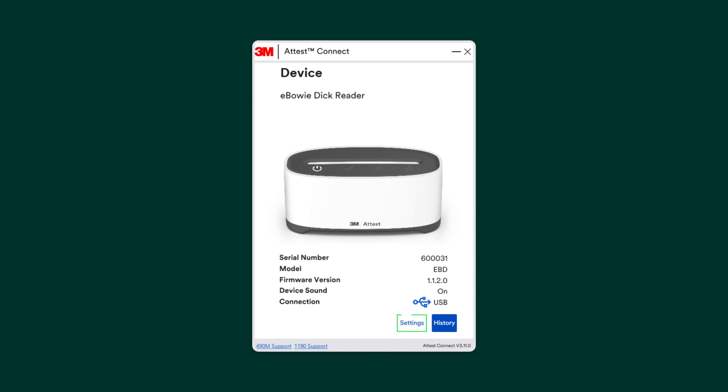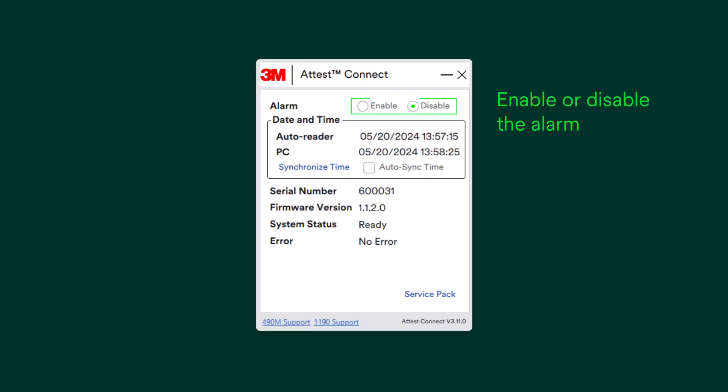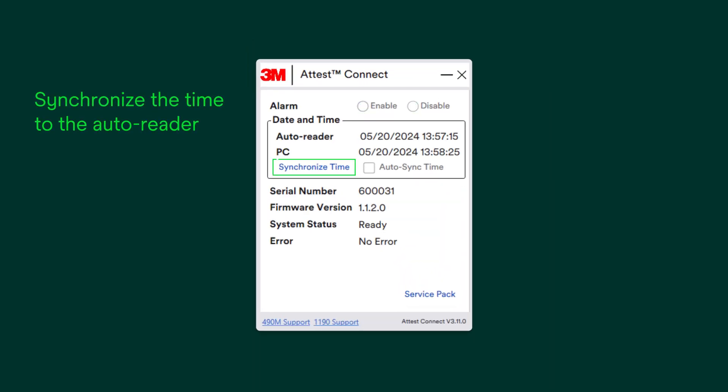Click on Settings. Here, you can enable or disable the alarm and synchronize the time of day to the auto-reader. The Service Pack button is for generating a file for troubleshooting should that need arise.